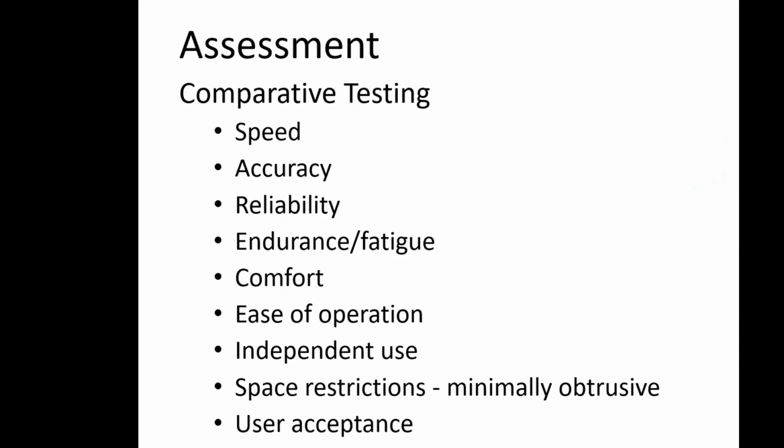We also need to look at some different things for testing. So we want to compare different things, such as, if we're looking at two switch sites, for example, which site do they have the best speed and accuracy? Which one is the most reliable for them? How's their endurance or fatigue level in a particular spot for that access?